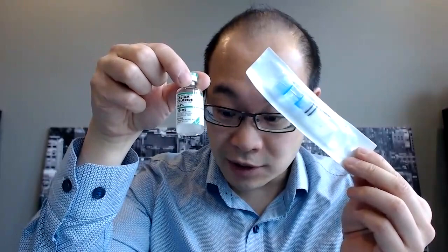So this is an insulin pump reservoir. And you know, it's funny, when I used to work in Safeway, I had a couple of insulin pump patients and I'd be handing them this stuff all the time, but I had no idea what was inside. Let's get this closer. So this is the part which I'm going to fill with insulin, but I'm just going to do it with saline today, and then I'm just going to insert it onto myself.